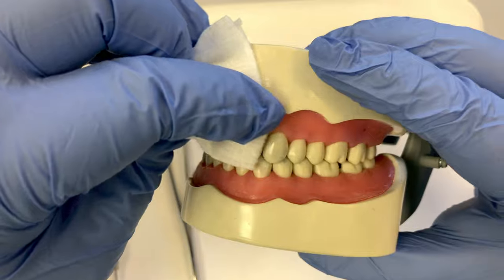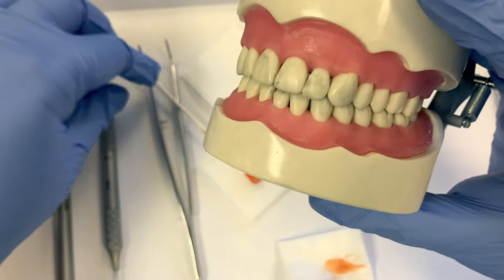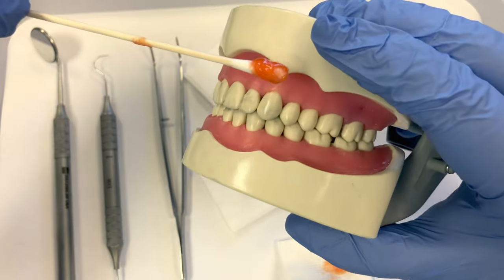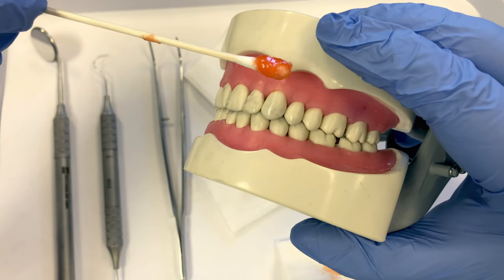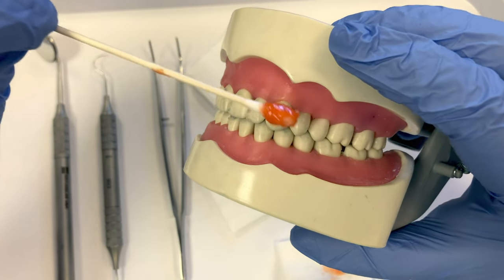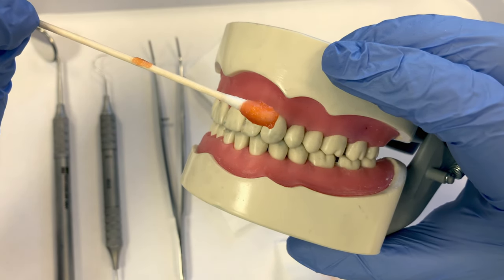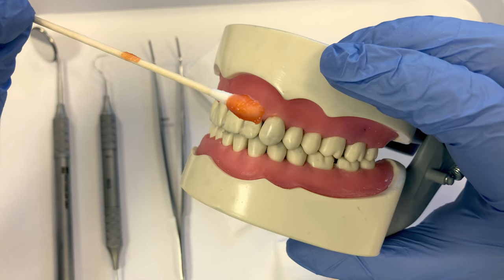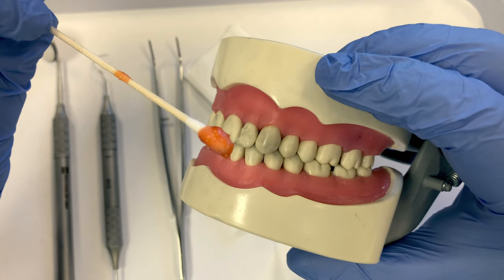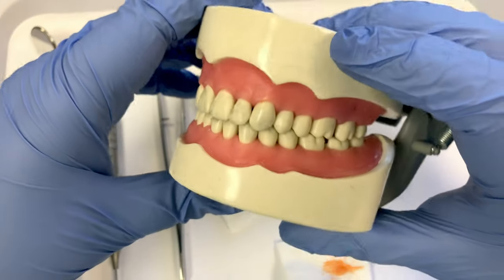There are also profound topicals on the market that work faster and provide a deeper numbing sensation, but this demonstration uses a typical topical anesthetic. Remove it right before the doctor gives the injection and wipe away excess material. Don't use too large a glob — over-applying will numb the throat, the saliva will wash it away, and when the patient's throat is numb they'll feel like they're choking, creating a very uncomfortable dental experience. This topical anesthetic wears off in about ten minutes.